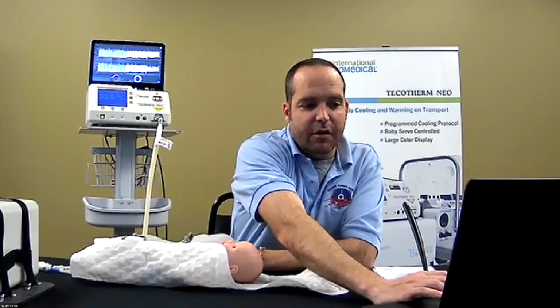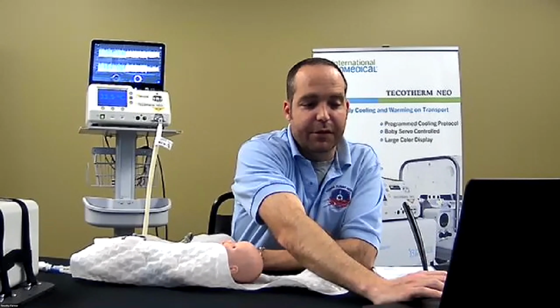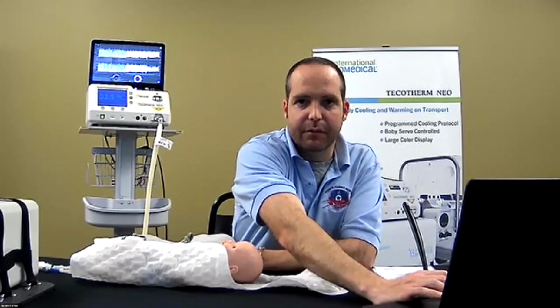So if you were going to use it for normothermia, would you use a core temp probe or would you maybe go with a skin temp probe? Right now, we haven't actually used that in that way on transport. I'm thinking that we'd probably use a skin temp probe, constant mattress temp, most likely, and then monitor it from that.